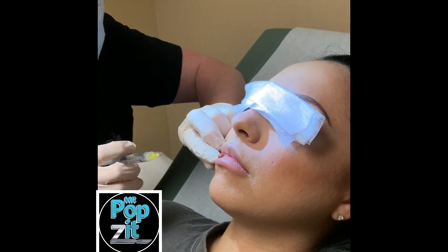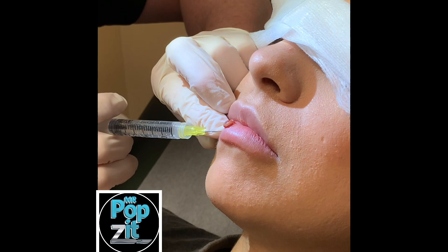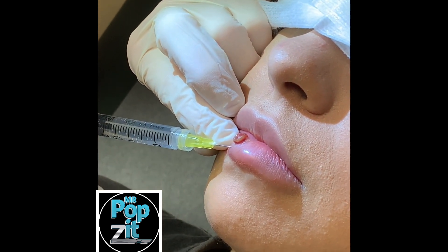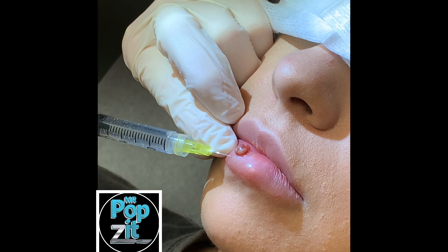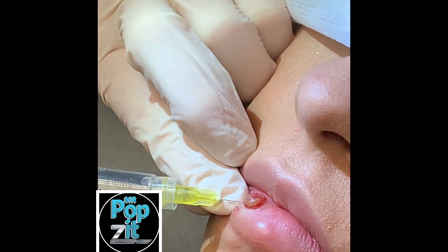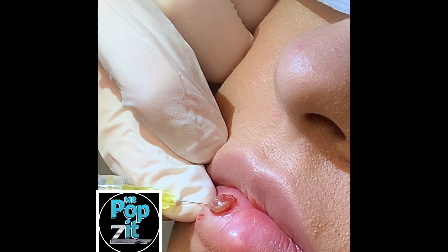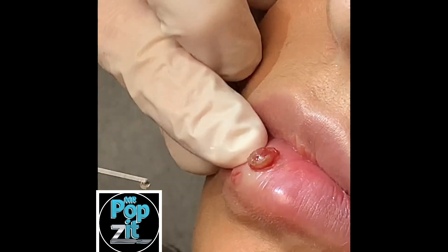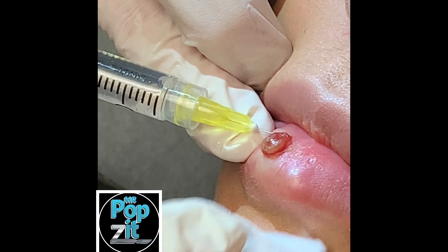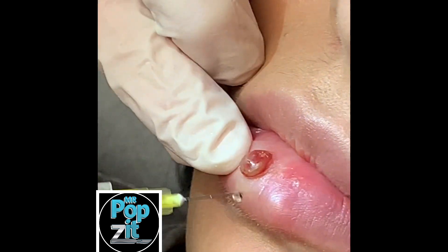So it's going to be a little pinch on the lip. Nice and slow. It's going to balloon up the lip a little bit and that'll go down in about an hour — you'll see some swelling on your lip, that's normal. A little on this side here. It's like a temporary lip filler.